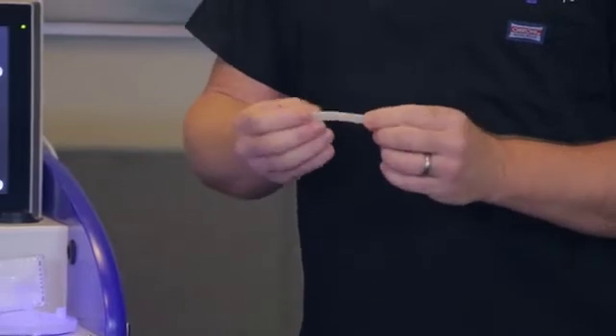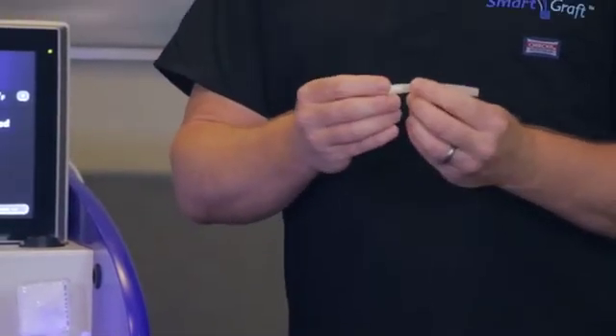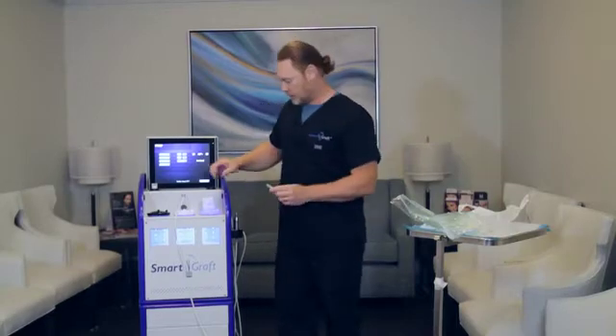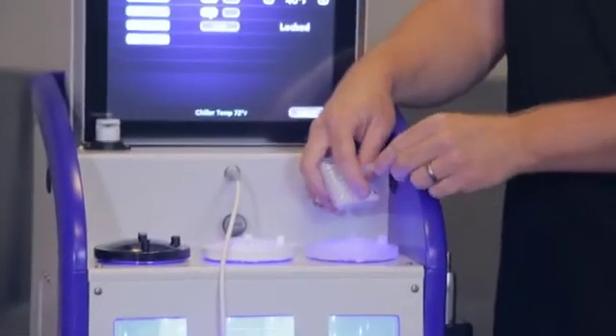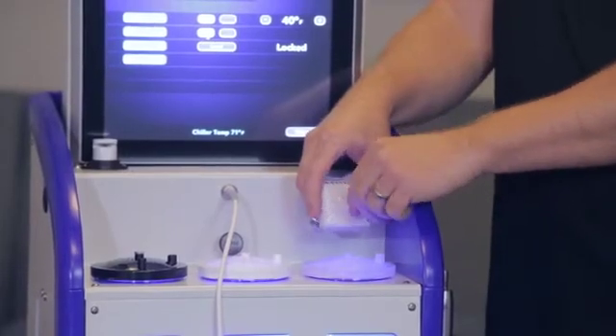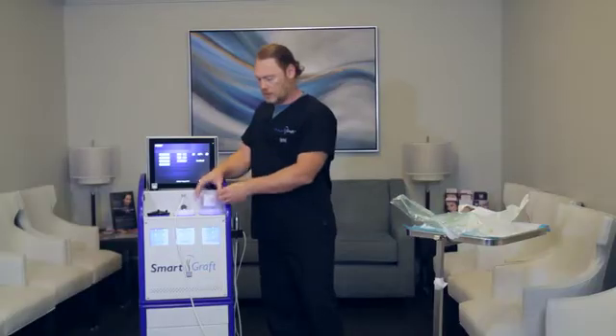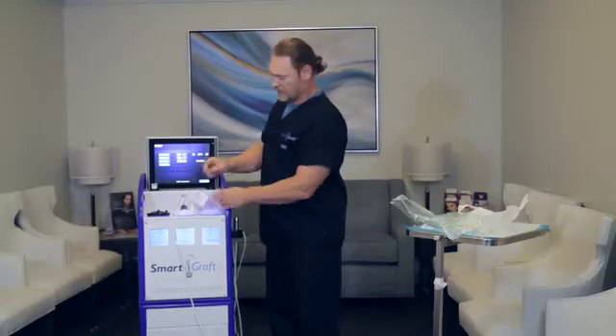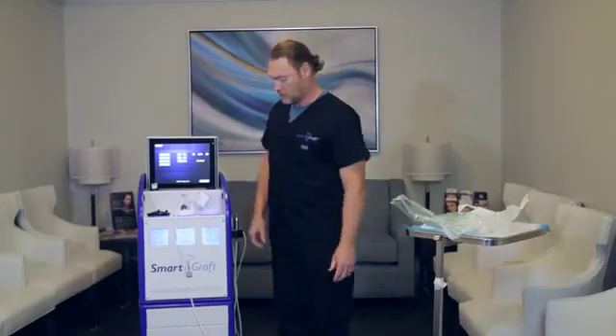The first tube that I like to put on is the one to the filter. If you notice, it does not have a nozzle tip on it and this will connect right to the filter and just slides on. It does not have to go on all the way. Now this nozzle tip will go right into the next hole to its right-hand side and that's its proper location.